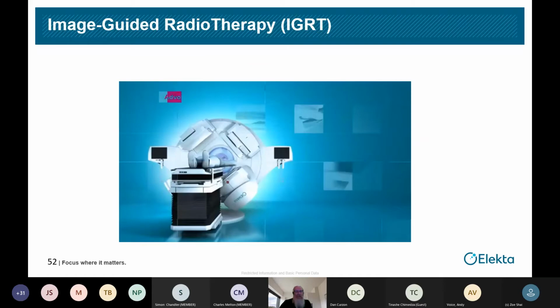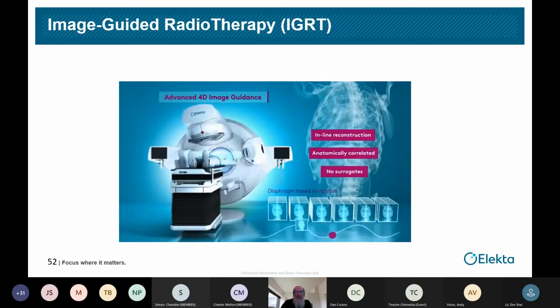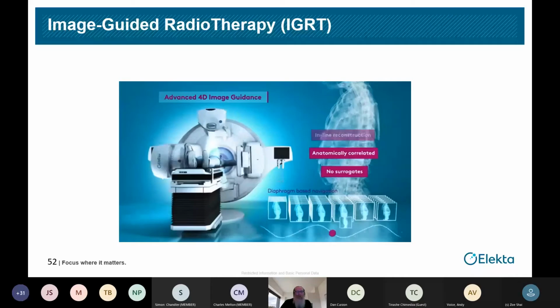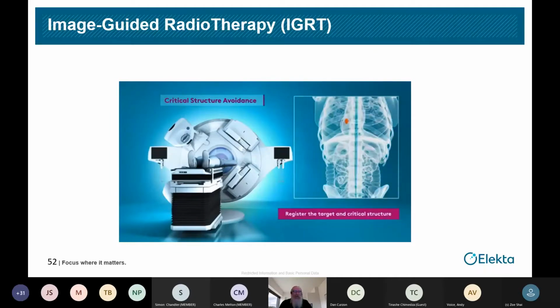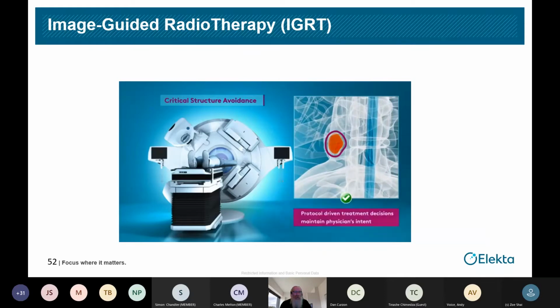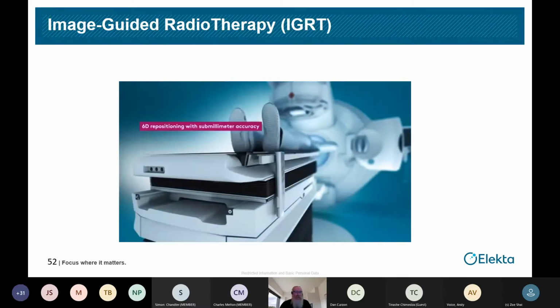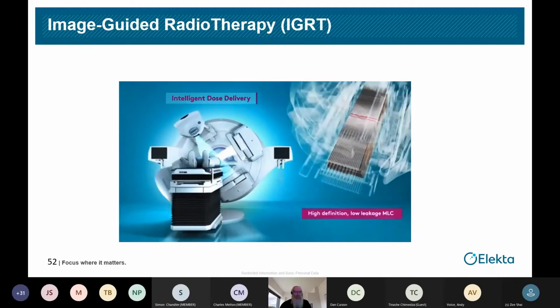The other big thing we brought in early 2000s is image-guided radiotherapy. This is where I said about those other arms. So the extra arms there are a CT scanner, effectively. So we can rotate around the patient before treatment like this with the CT scanner, and we can actually see where the tumor is within the patient just before treatment. And then we can use a 6 degree of freedom table to adjust the position of the patient in all six degrees, so that the tumor is back where we thought it was from the planning scan.